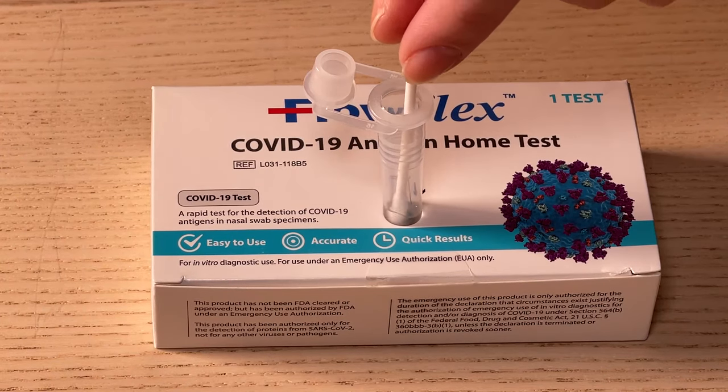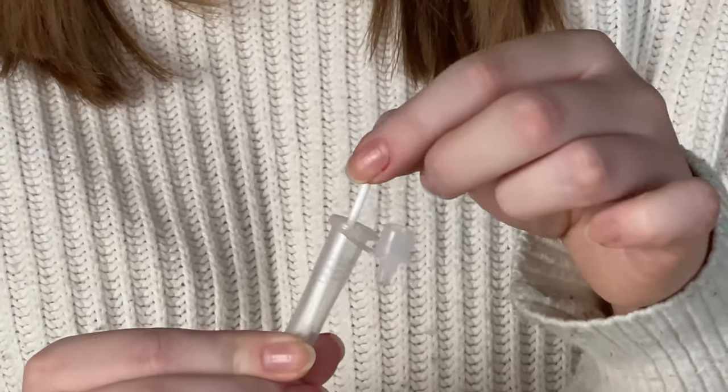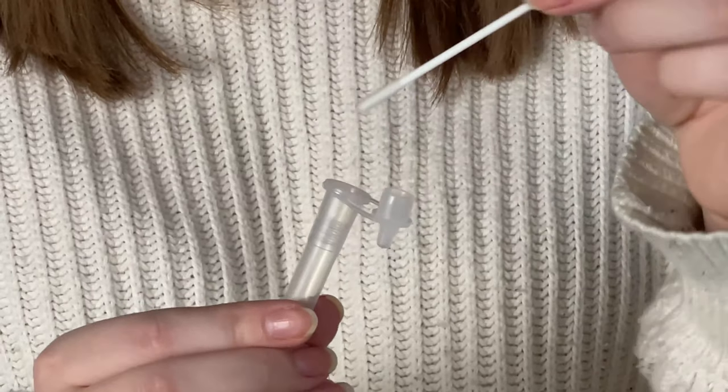When through, immediately place the swab into the extraction buffer tube and swirl it for at least 30 seconds. Then take the tube out of the tube holder and squeeze the bottom of the tube while you rotate the swab five times. While still squeezing the tube, remove the swab and dispose of it. Attach the dropper tip firmly into the tube.